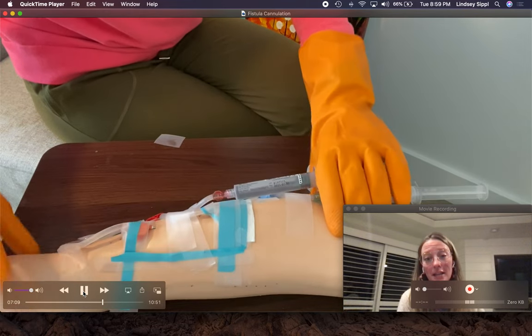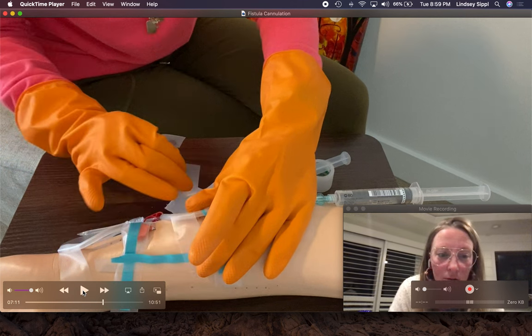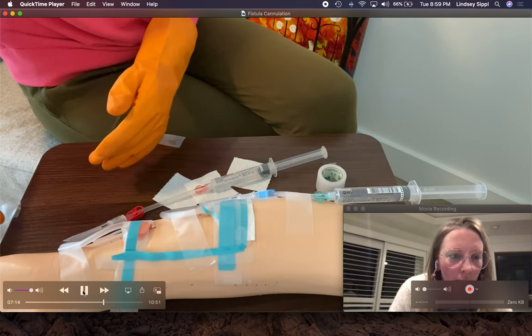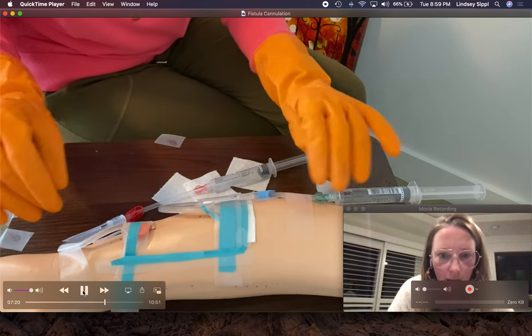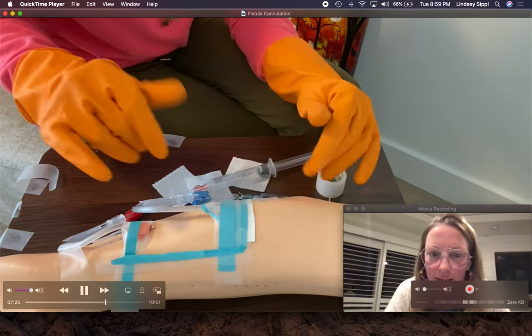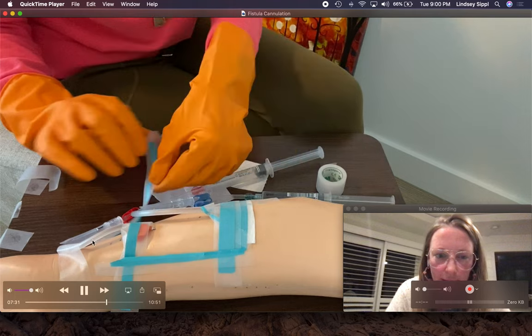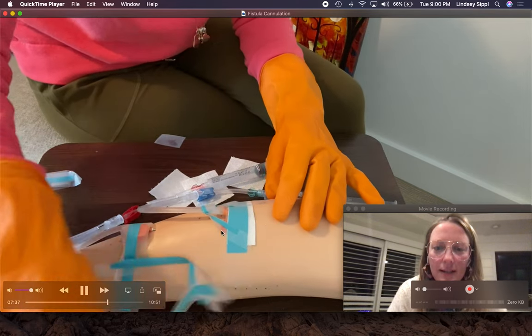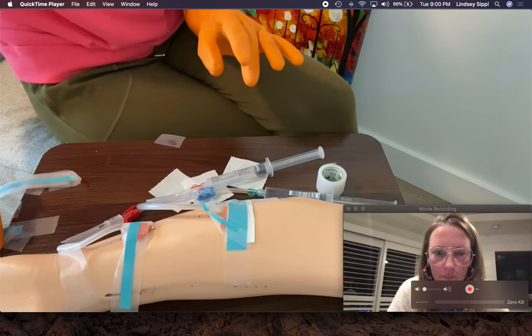Now it's time to remove the tape and take the needles out. At our facility, the needle that is most proximal to the patient — the venous needle — is the one we take out first. That makes it easier when the patient holds pressure, because we're not crossing over. If the patient is already holding the arterial site, you'd have to work around that to reach the venous needle. So we do the venous needle first, the most proximal needle. This takes some practice.